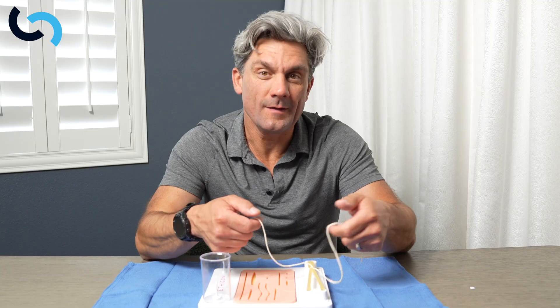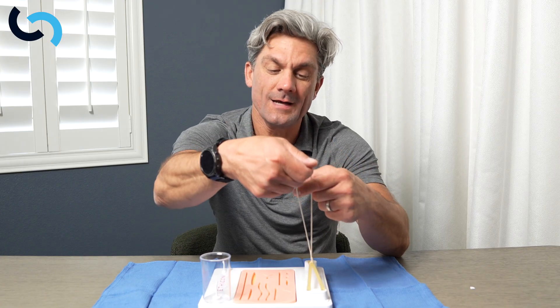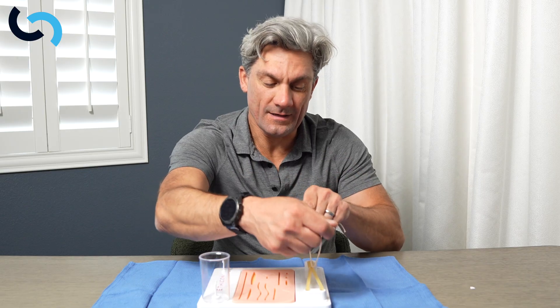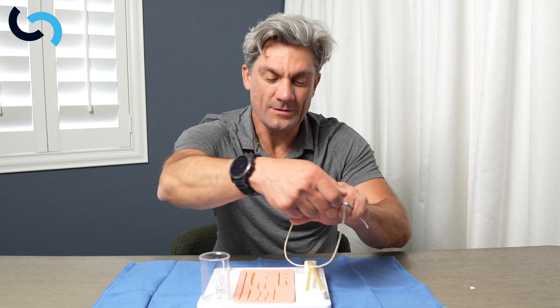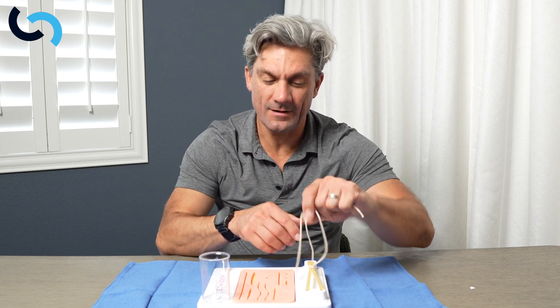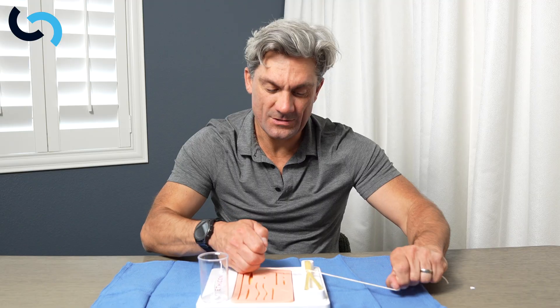Now we're set up to do it again. Index, cross, thumb through, index on, over — and that's gonna go down nice and square. You can see that going down square. We do that again: thumb through, over, index under, thumb back, pull it — and that's nice and square.